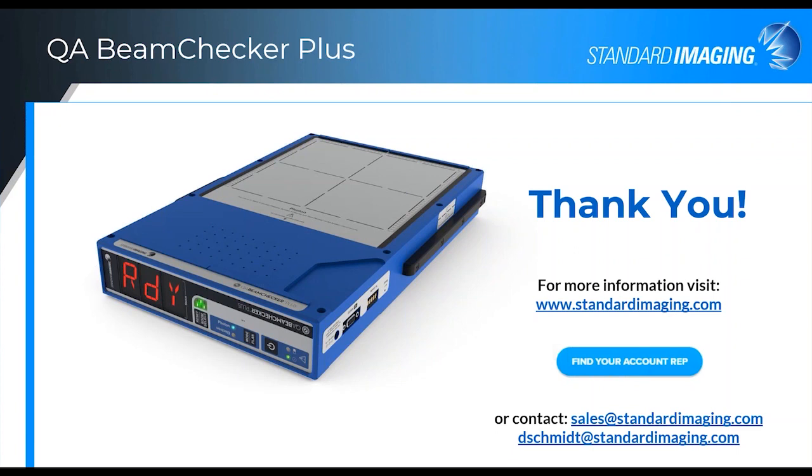I think the beam quality question, this is similar. So measuring the beam quality, if we're talking about the energy that is inherent in the measurement. So the energy score is essentially a measure of the beam energy, and that is the trigger that then allows you to identify what the flatness and symmetry and constancy are at that time.